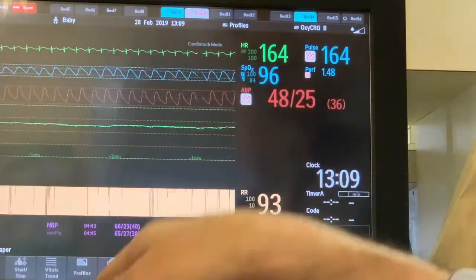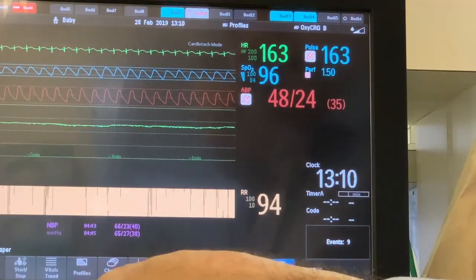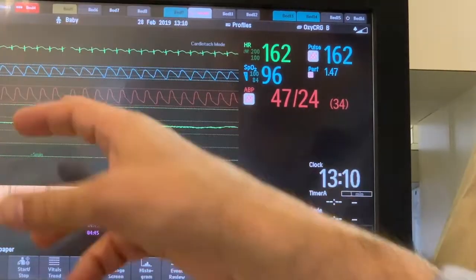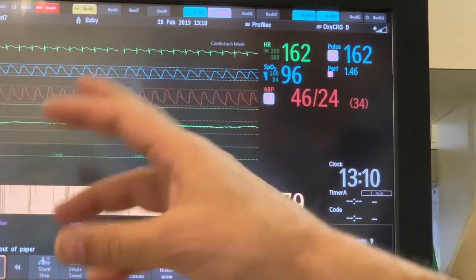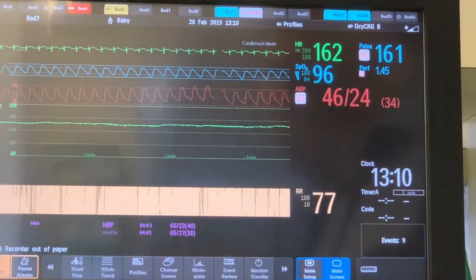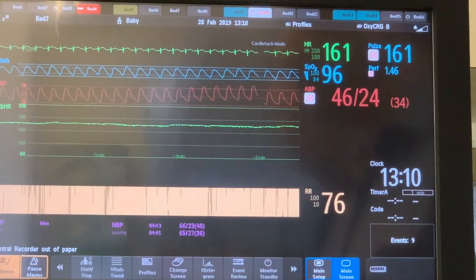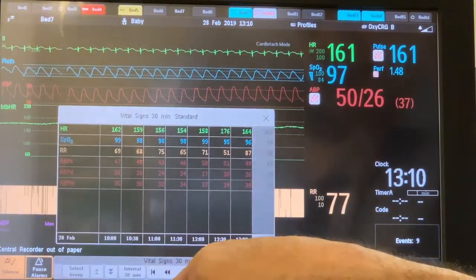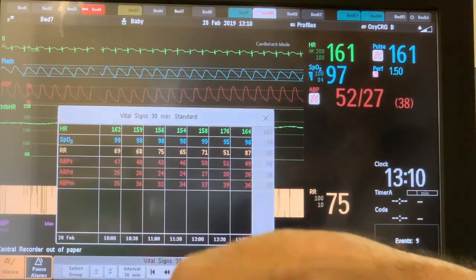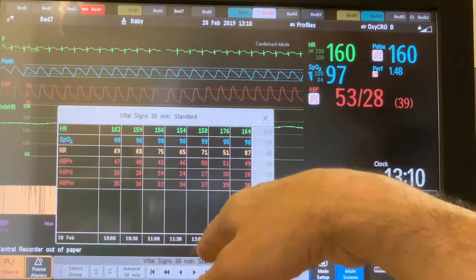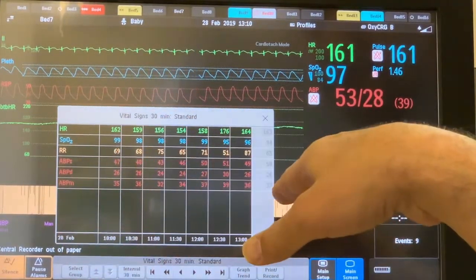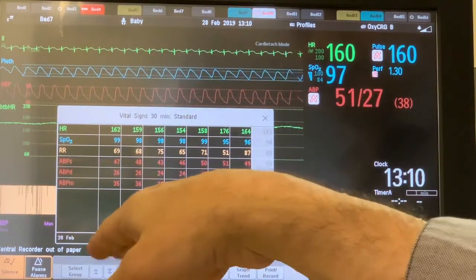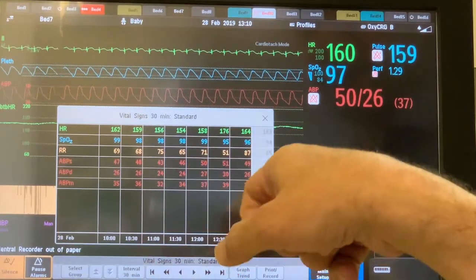You can do the same for mean blood pressure. But if you check both systolic and diastolic and both are within acceptable histograms, that should be enough. You can also check vital signs as a table, available every 30 minutes or every hour.